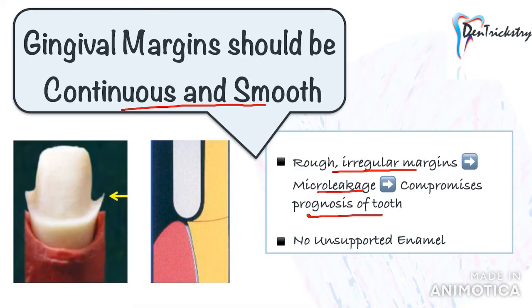Make sure there is no unsupported enamel, which is especially a concern with chamfer margins. The chamfer margin should never be prepared wider than half the tip of the diamond burr. Otherwise, unsupported enamel is formed, which will chip off, resulting in an inaccurate fit of the crown.